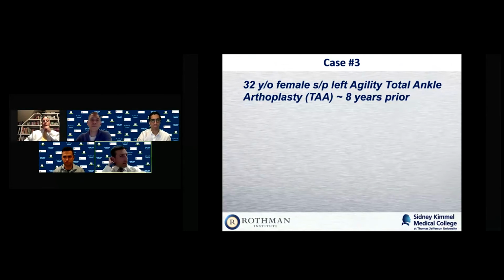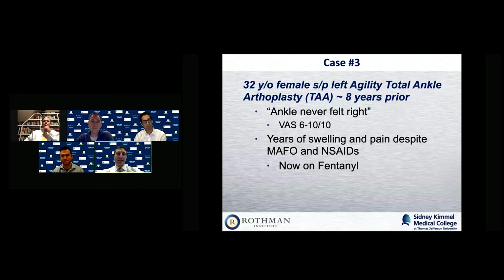Sure. So this is a case that I did, probably about 6 or 7 years ago. It's a 32-year-old female. At the time I saw her, she had an Agility total ankle replacement about 8 years prior to seeing me. So, do the math, 24 years of age, which is a topic of a different discussion. She said that her ankle never really felt right, just had constant pain, up to 10 out of 10 on VAS scale, years of swelling, treated non-op with braces, MAFO, NSAIDs, and now was being managed by a pain management specialist on fentanyl.